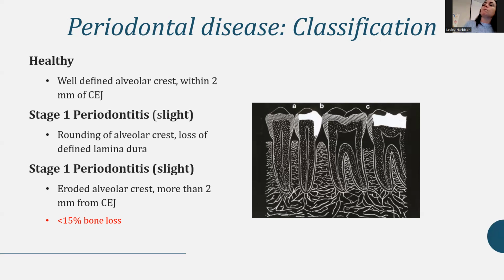During ortho, can you have a widening? Yes, definitely. Ortho. Because you're moving stuff around, right? You're messing with the PDL and the bone and everything. So yeah, for sure. And ortho, you can have all kinds of funny things happening.